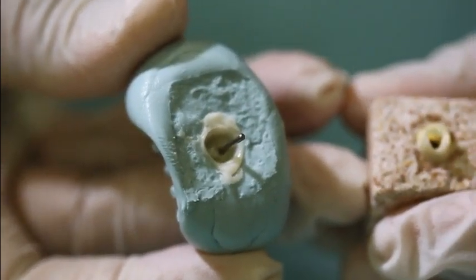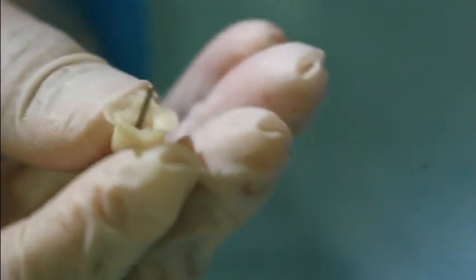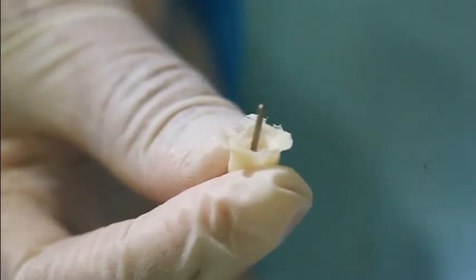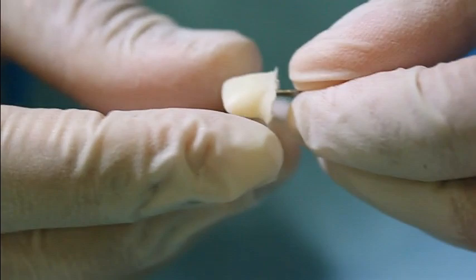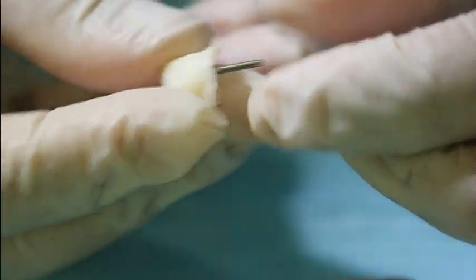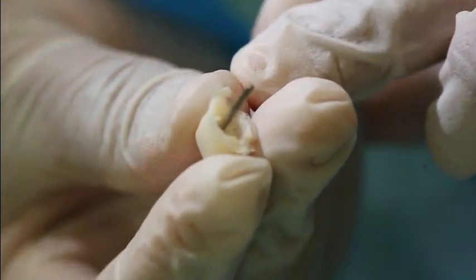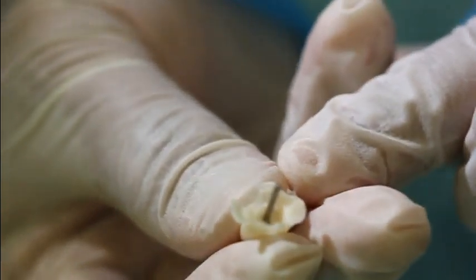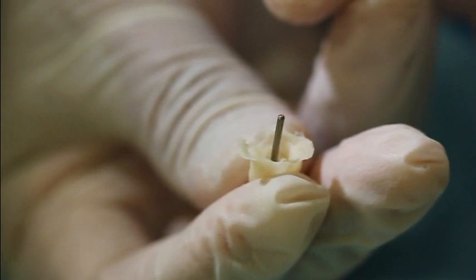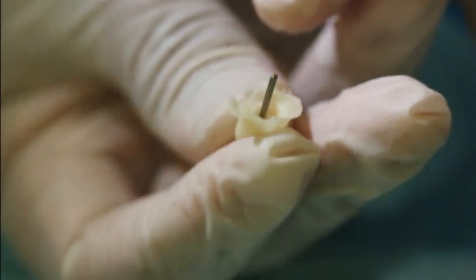Okay. When it's set, take it out from the silicone putty. Make sure the temporary post sticks into the temporary crown, and check all the margins. Make sure all are recorded.